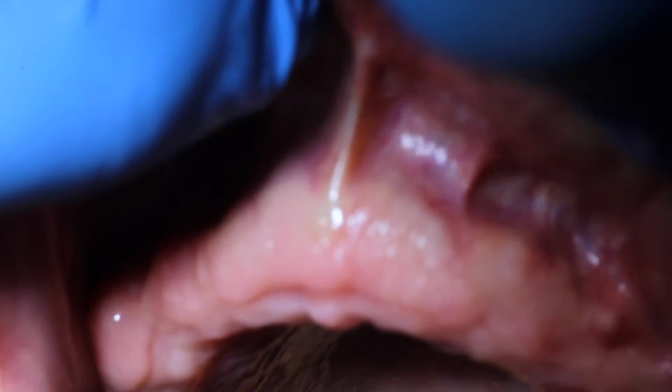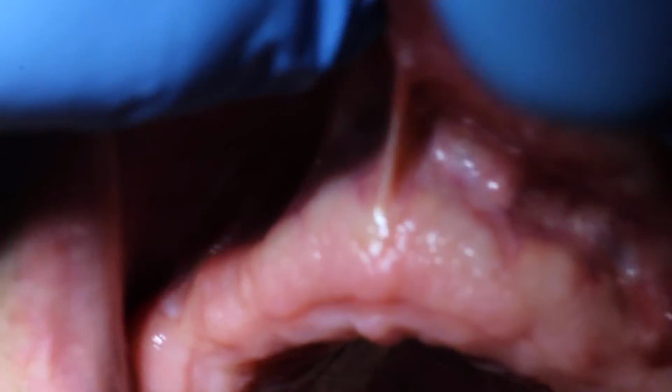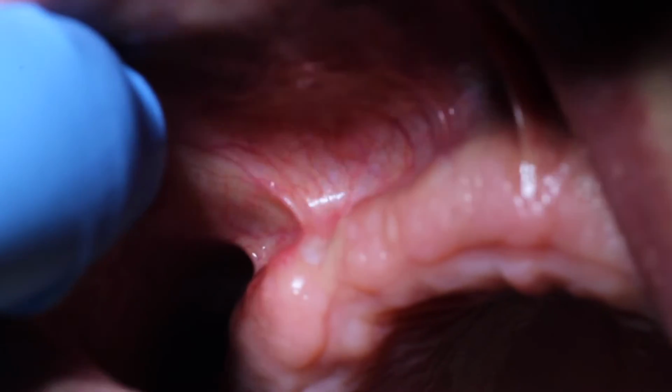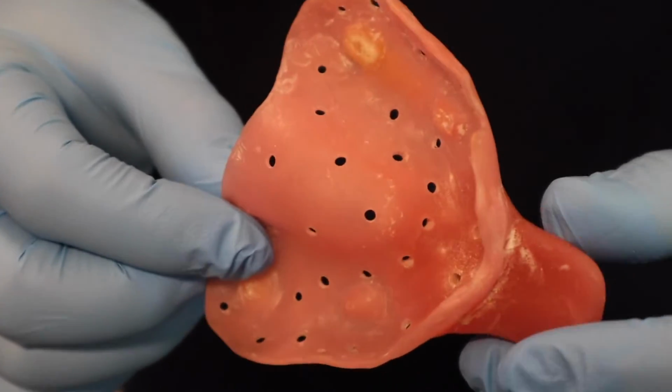So when you're making a denture, essentially what you're trying to do is to grab onto as much ridge as possible without disturbing any of the movable tissue. You see how some of this tissue is moving around. There's frenums, so there's attachments, and all this stuff moves when the patient talks. And so you want the denture to grab onto as much as possible without interfering with these areas. And so I'm going to go ahead and show you the way that you adjust your custom tray.